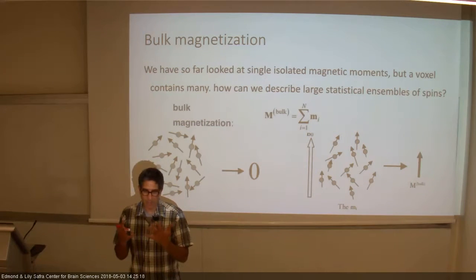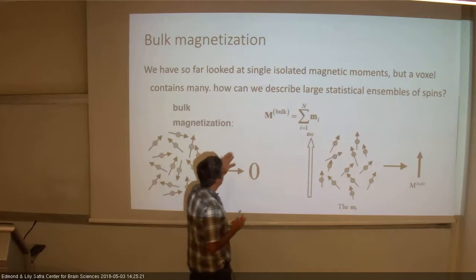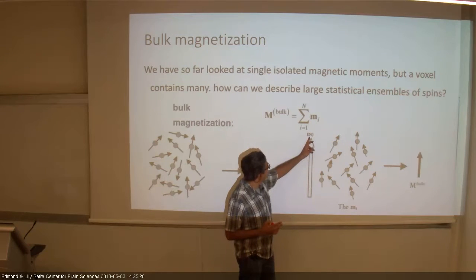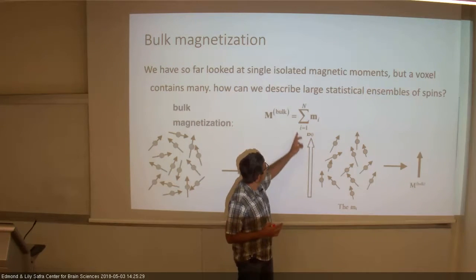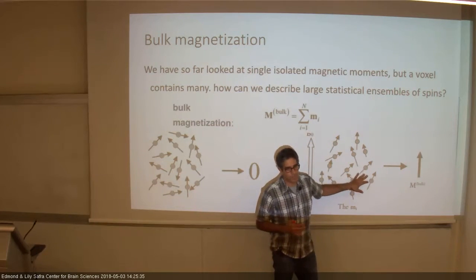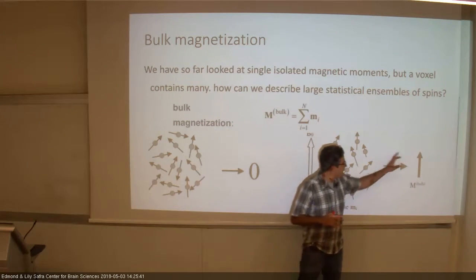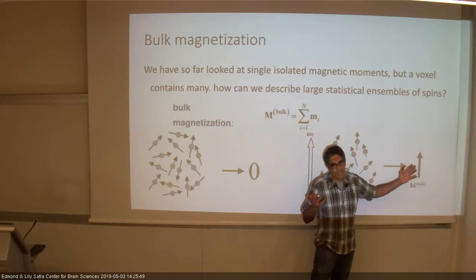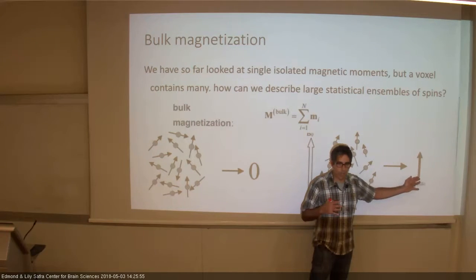Okay, so using this intuition, you can think about these proton spins that now start to align toward the magnetic field. So this is going to be the B0. And we sum them, and we start to get a vector, a magnetic vector. This is a quantum phenomenon, and I'm giving a hand-wavy explanation. The summary of that, creating a magnetic vector, is already non-quantum. We can explain that and work with it as a classical physics phenomenon, a magnetic vector that we're going to play with.